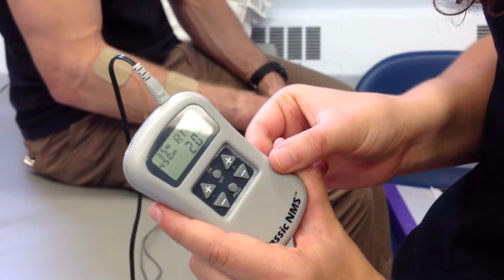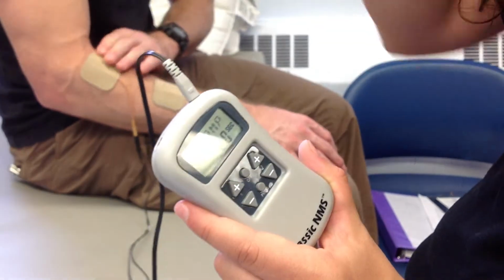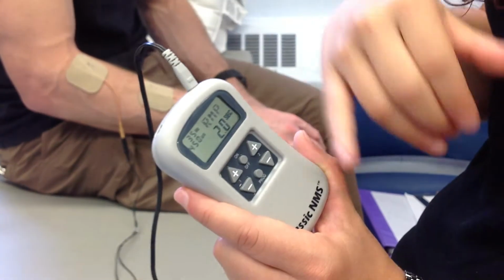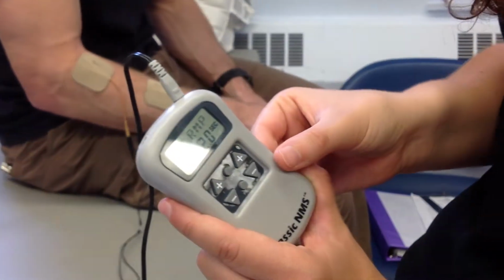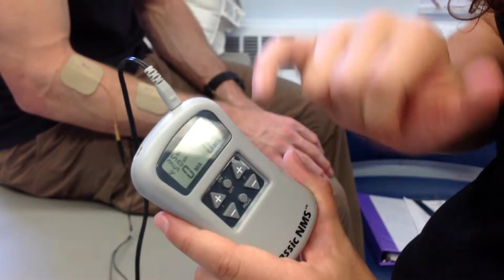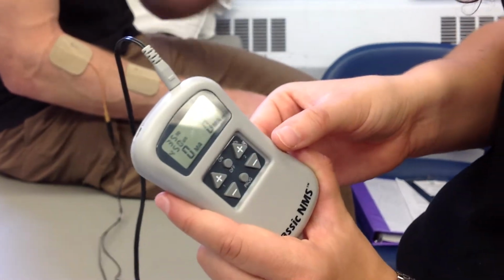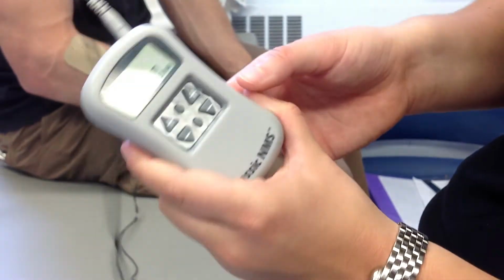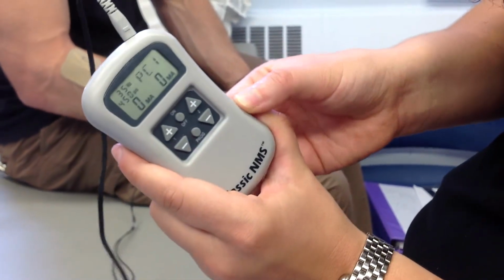You hit set again, ramp, so it takes 2 seconds to ramp up. You could change that, usually like 1 or 2. Sync, you just keep it 0. And then once you get to sync, you hit this button, which is escape. You hit escape, and now it's set.